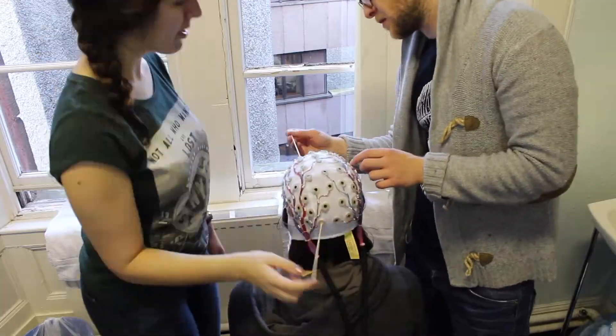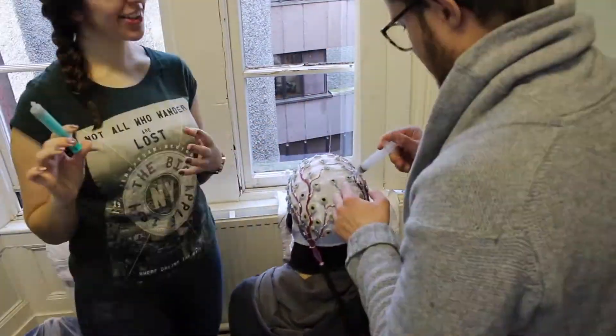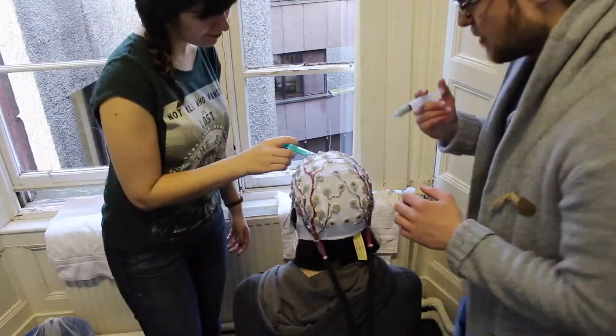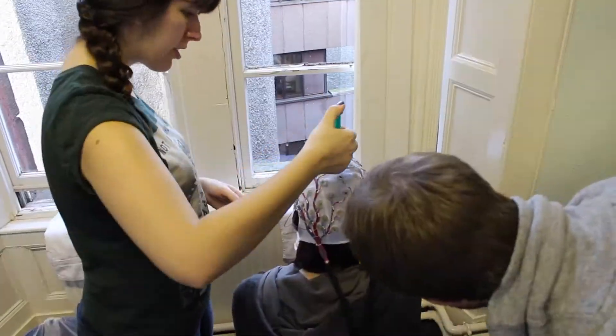Once you have distributed the gel around all of the electrodes, fill each one back up with gel. Once this is done, you are ready to take the participant through to the booth to begin your task.